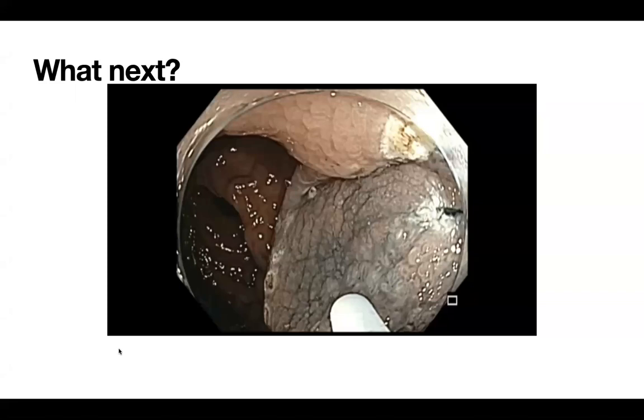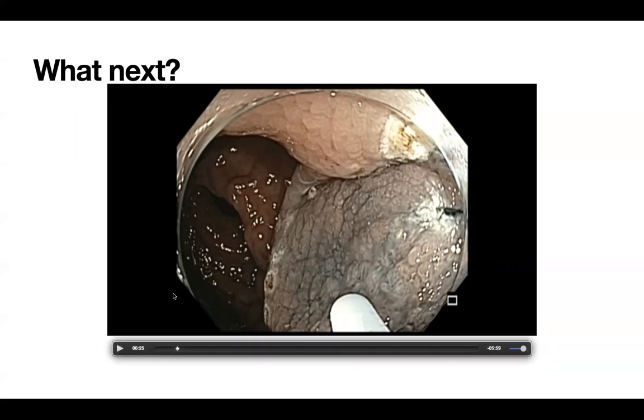If you remember, a long time back, almost 7-8 years back, when we were talking about serrated adenomas, normally we don't see much of them in the rectum. But I've seen one patient where we had a serrated adenoma with low-grade dysplasia low in the rectum. When I saw this epithelium that looked a little bit different, I said, okay, I better cut this one, because you don't want to just cut the sessile polyp and then have difficulty cutting the rest of the area.